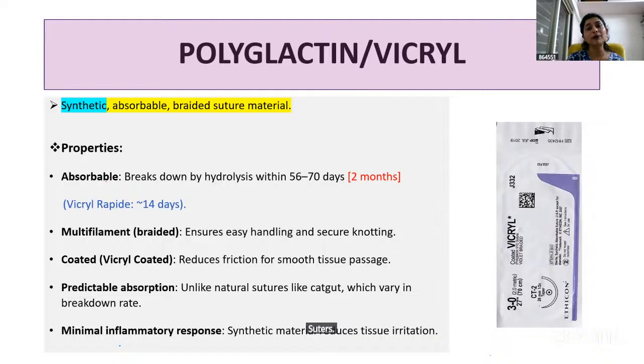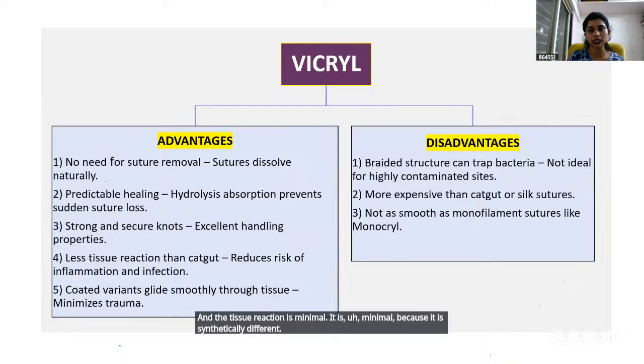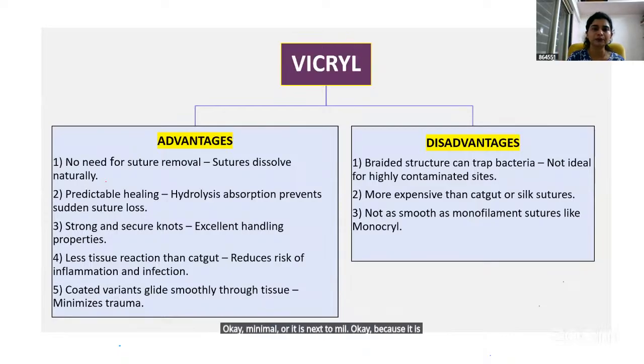Absorption is predictable. It is not as unpredictable as surgical gut. So that is a good thing. And the tissue reaction is minimal. It is minimal because it is synthetically derived. Okay, minimal or next to nil, because it is synthetically derived.